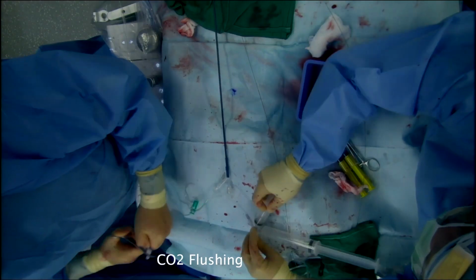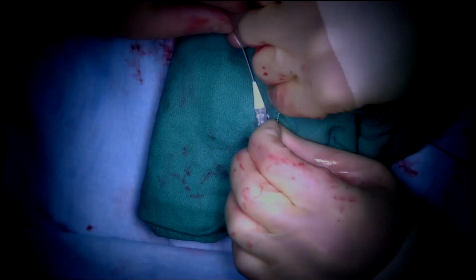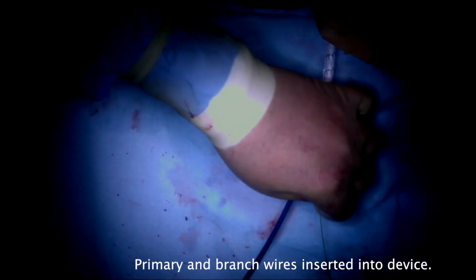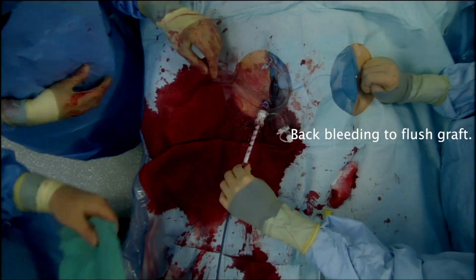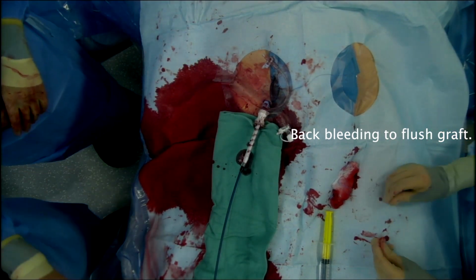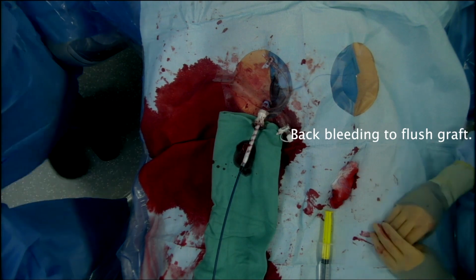The device is then flushed with CO2 as seen here. The primary and branch wires are then inserted into the device to be able to advance it through our access to its appropriate position. The device is then partially advanced into the groin sheath, allowing back bleeding through the endoprosthesis to flush the graft and avoid any air emboli during eventual deployment.